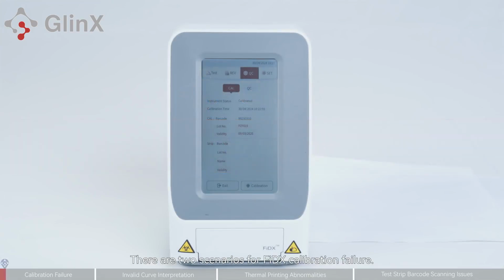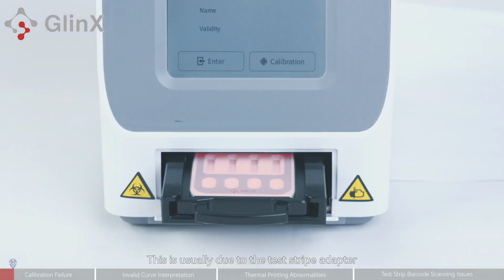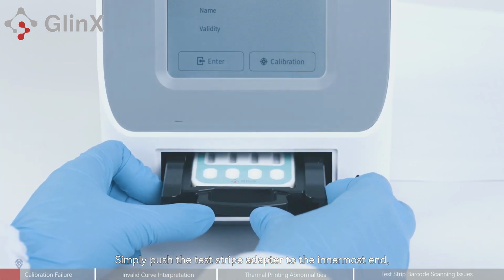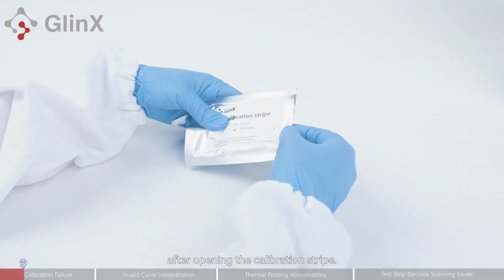There are two scenarios for FiDX calibration failure. Scenario 1. Both K and R square values show abnormalities. This is usually due to the test strip adapter not being fully inserted. Simply push the test strip adapter to the innermost end and retest within 30 minutes after opening the calibration strip.